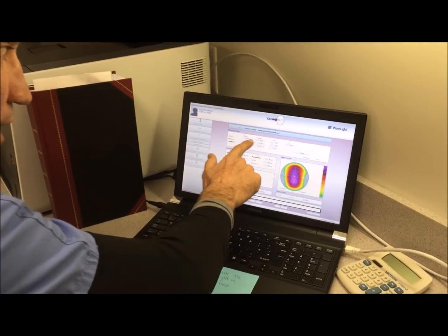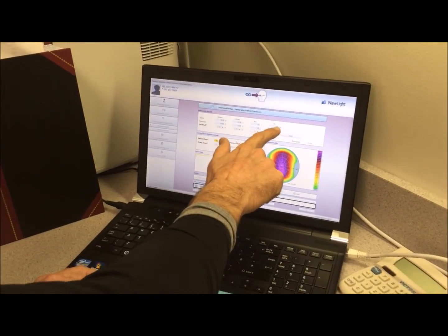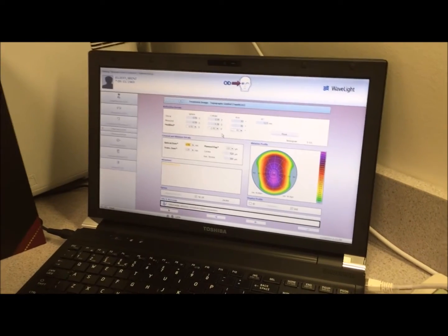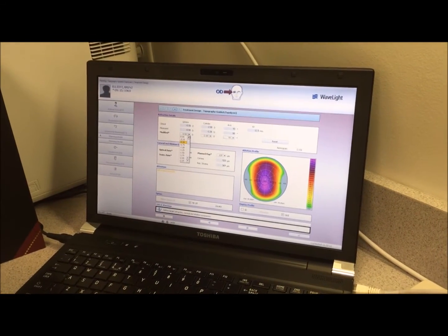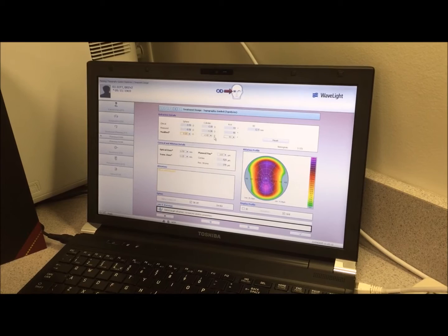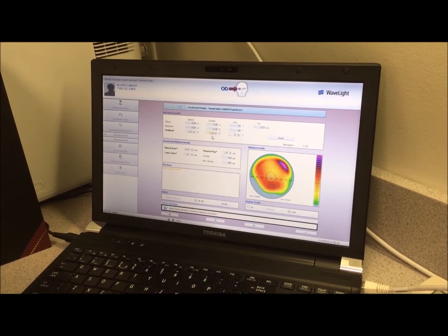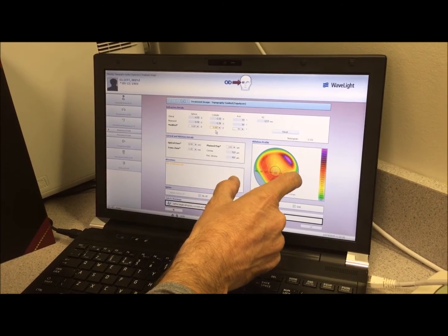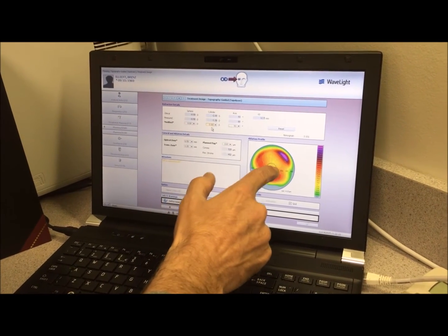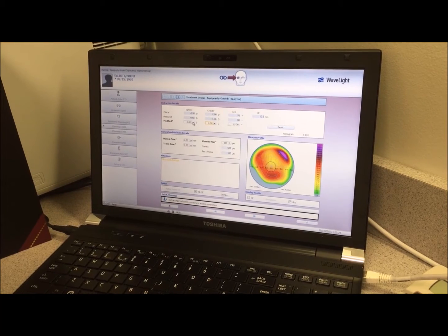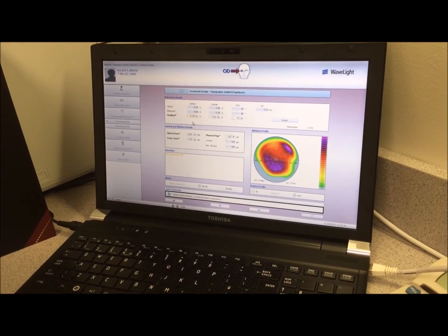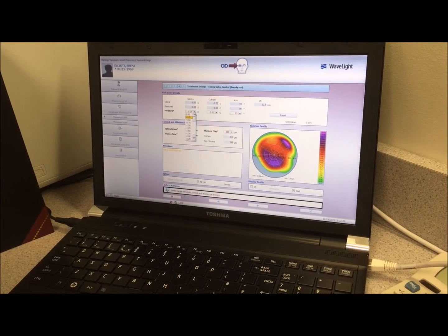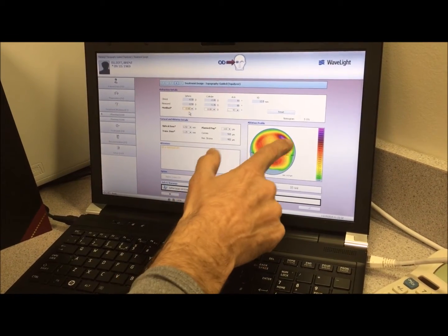Once I've decided which pictures I'm going to use, I enter in my treatment and then back that treatment up to see what the TCAT is treating — what the Contour Vision is actually treating. What topographic changes will we be making on this corneal surface minus the refractive error. What we're looking for is whether we're inducing any elements that may cause nearsightedness, astigmatism, or farsightedness.